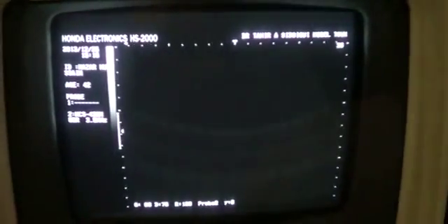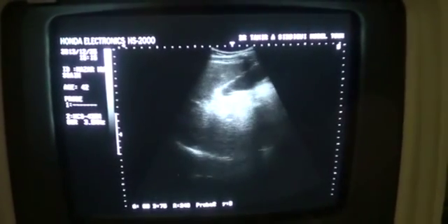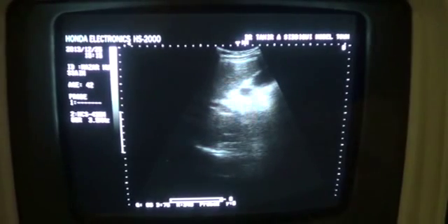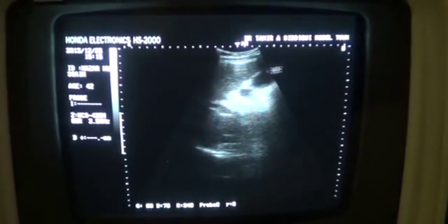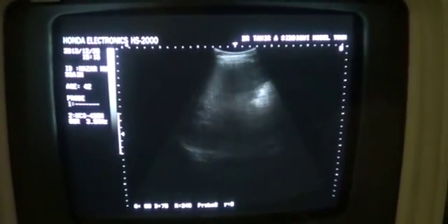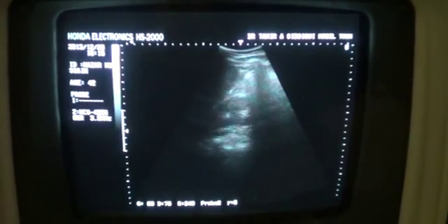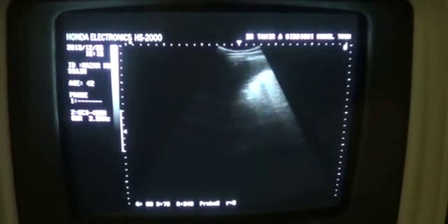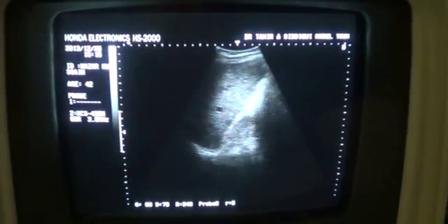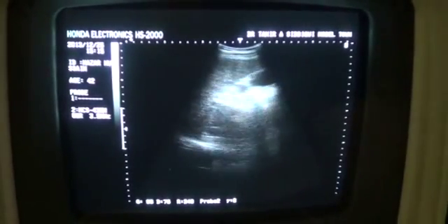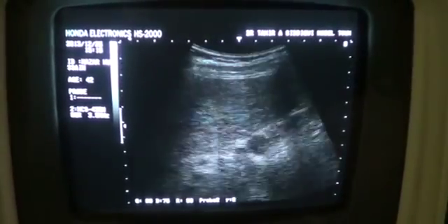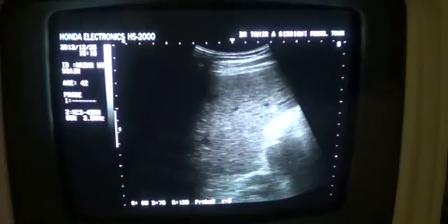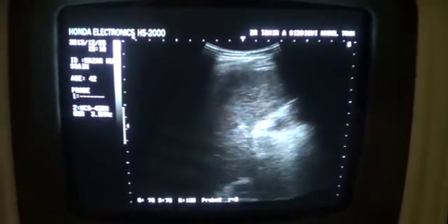Now I'm going to scan the patient. Let's see what is the status of the liver. This is the gallbladder, and you see the portal vein running at the right angle to its neck — this is the gallbladder, portal vein. This is the right kidney, with liver and right kidney together. Both kidneys are normal, gallbladder is fine with no significant findings. See the texture of the liver — the texture of the liver is coarse and there is increased echogenicity throughout.